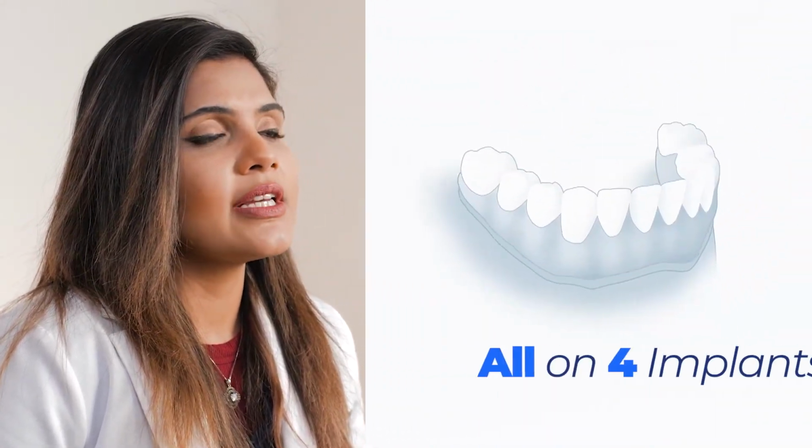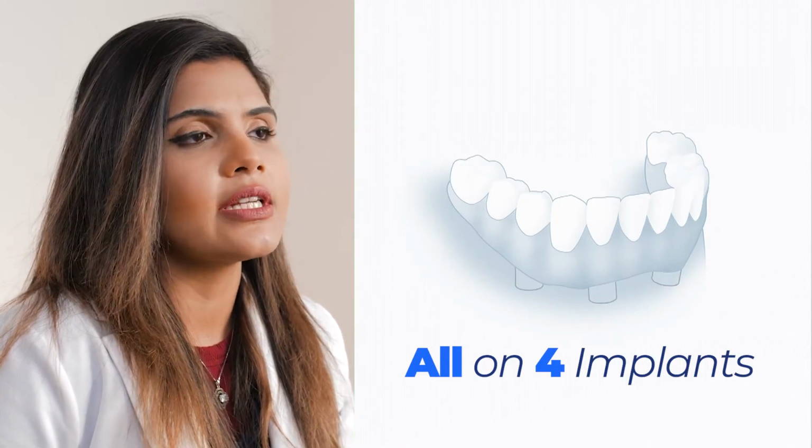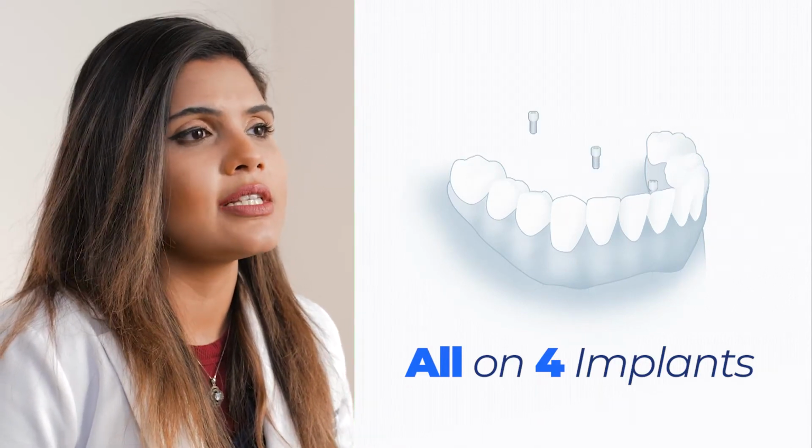The third scenario in which dental implants can be used to rehabilitate a patient's smile or dentition is to place implants in an all-on-4 fashion, where implants are placed, either 4 to 6 implants depending on how much bone you have, and then those implants serve as an anchor point on which the final prosthesis is fixed.